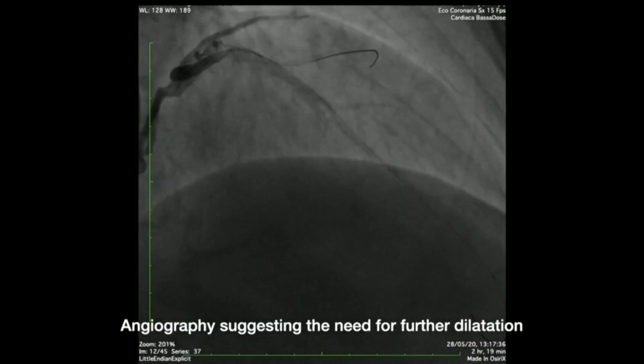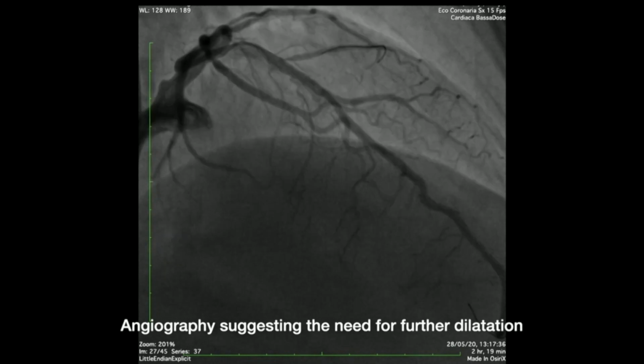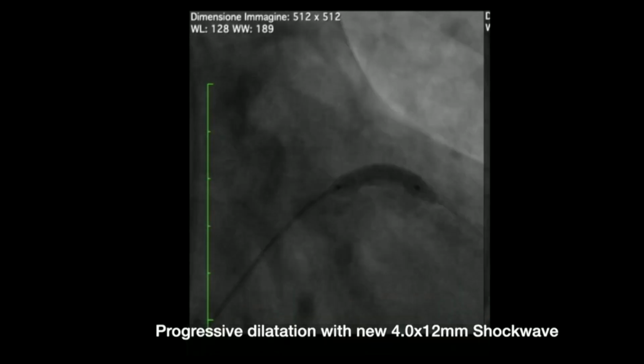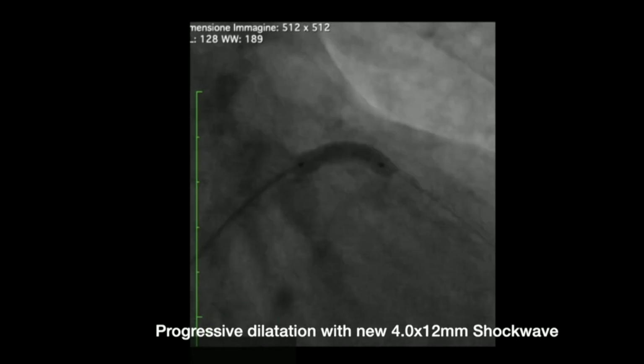Thank you very much. At this point, I think we are quite ready to know what you did next, how you solved the problem. Okay. Well, it's clear we are dealing with a young lady with a single vessel with a complex lesion of the LAD. This lady could deserve a mammary artery. So we have to do a good job to be competitive with the mammary artery. We did dilate, we did use IVL, it broke, but we know it's not enough.